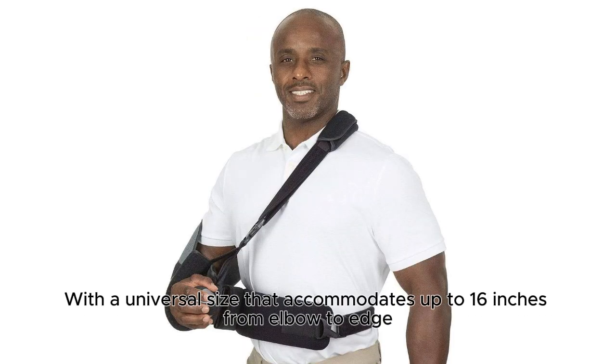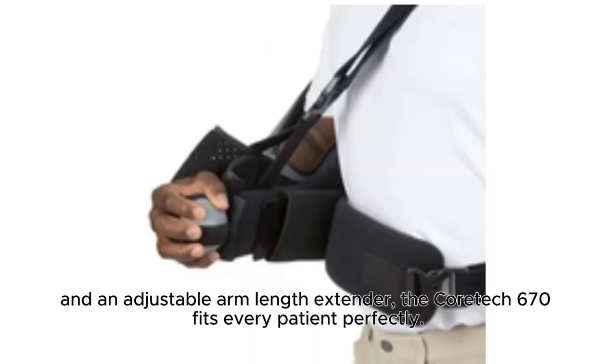With a universal size that accommodates up to 16 inches from elbow to edge, and an adjustable arm length extender, the Coretech 670 fits every patient perfectly.